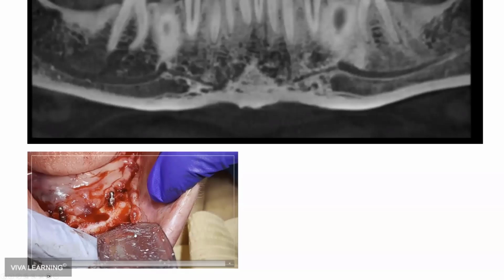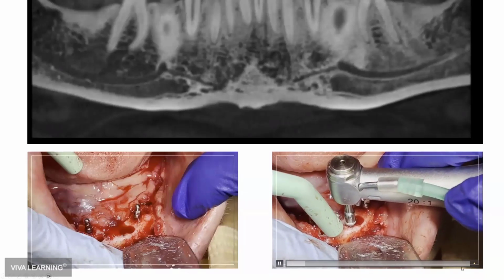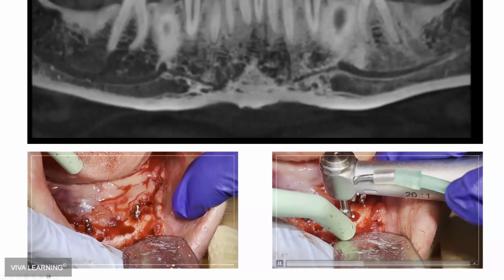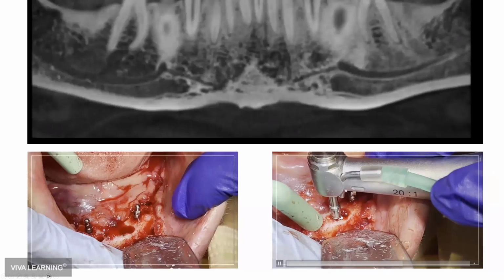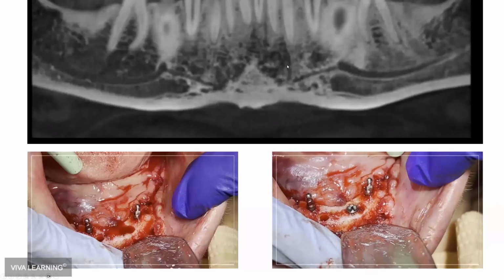But the most important thing is that intra-bony bleeds are pretty easily taken care of by either doing what we did here, which is place the implant, or some sort of tamponade to get it to stop. You know, it could be bone wax or bone graft or collagen or something to that effect. But in most cases, you're drilling it to place an implant, so you just place the implant. And the implant is a pretty good way to stop the blood. So that's the only thing you really got to worry about.